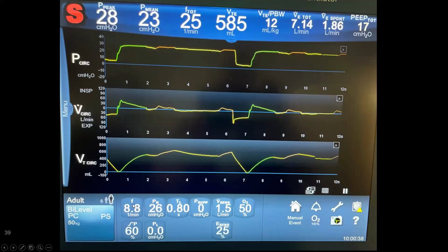See the frequency, see how the frequencies turn down because the P low, I'm sorry, the time low, you can't see that little window, but that little window of the time low is locked. So the time low is going to be the same at every breath, and you lower the frequency to stretch the time high out. And look how perfect as it inflates at P high, there's a nice spontaneous breath, it empties, and see how that volume is staying consistent in the lung, emptying it, releasing it, again, CO2, right? Emptying CO2. And so that's the smooth way it should be.